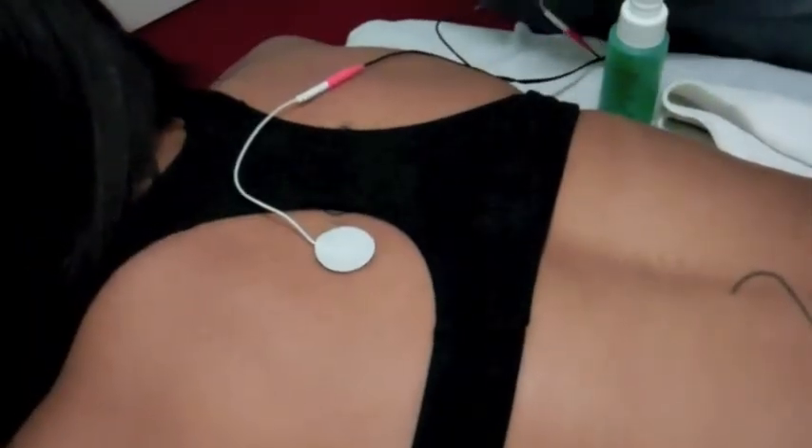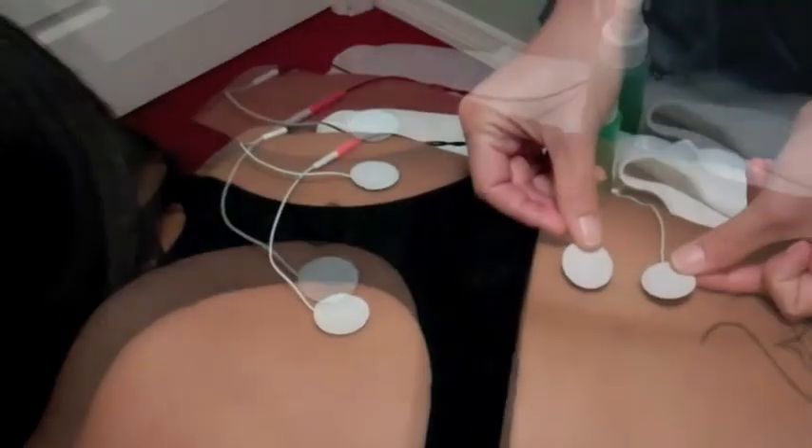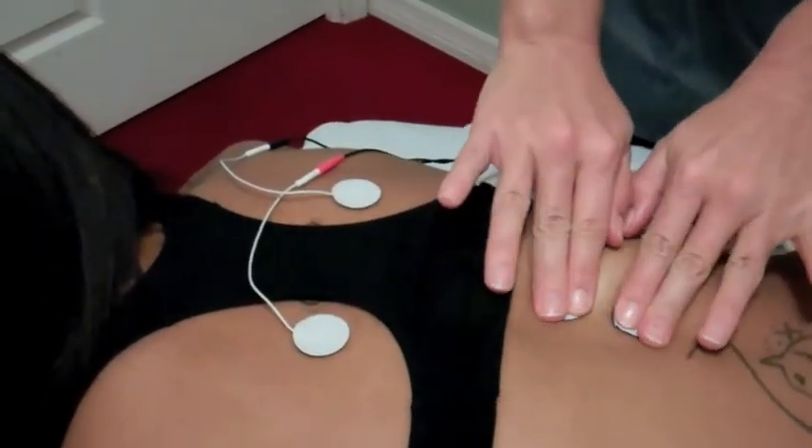Now that we have viewed the CriterionMed TENS and NMS basics, we are ready to begin fitting the electrodes. Before application, it is important to cleanse the area being treated with Aquaderm spray. This will prepare the skin for treatment and increase conductivity of the electrodes. Gently place the electrodes over the area in pain. You may also find surrounding the area of pain with electrodes to be relieving.